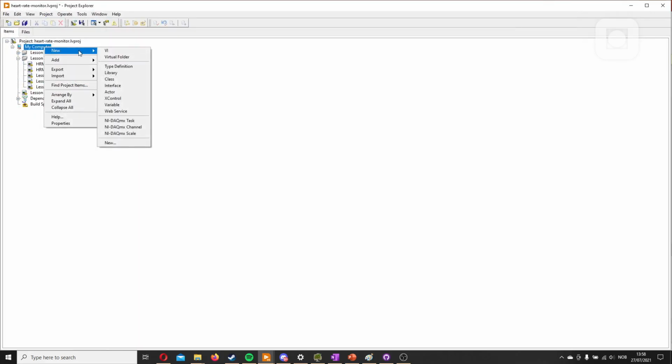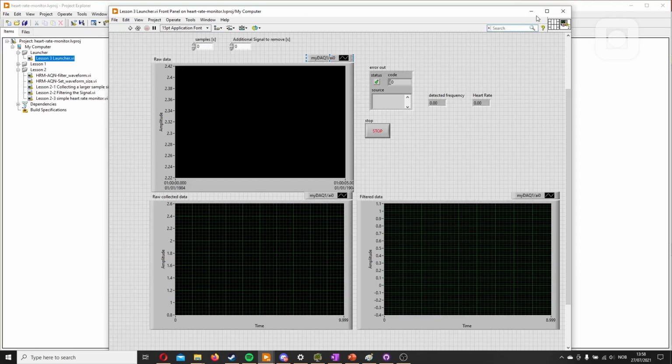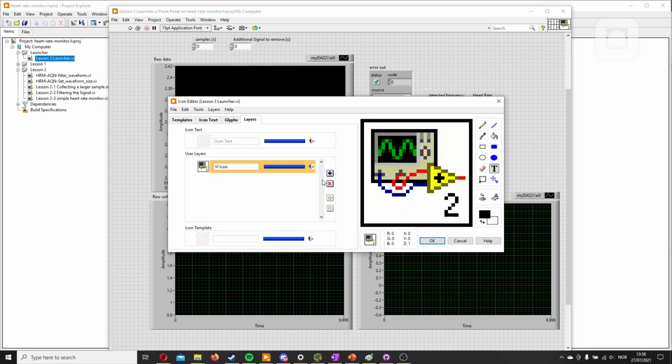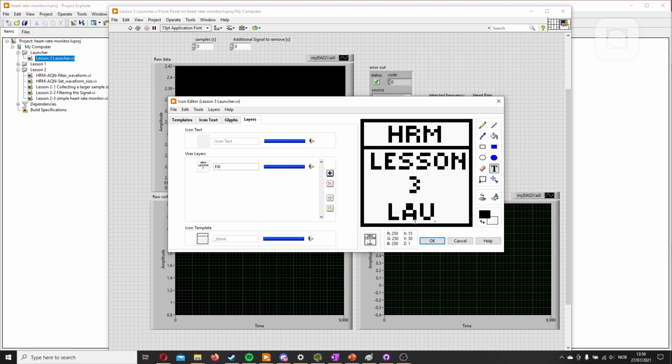We'll also make a virtual folder for this. You can now make the icon for this so it makes more sense. Heart rate monitor. Lesson 3. Launch. We can't fit launcher, so we'll just write launch.